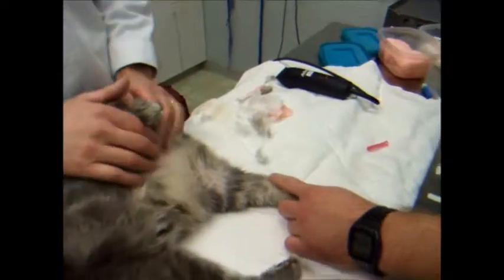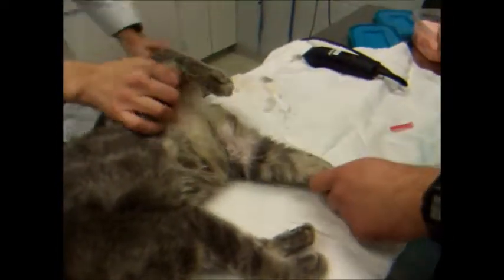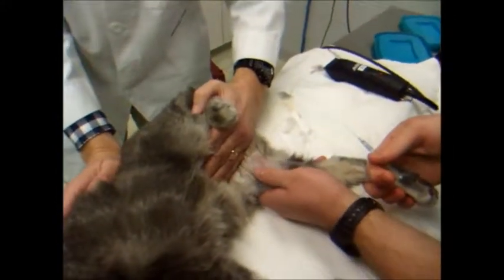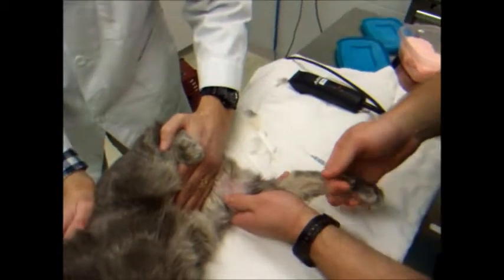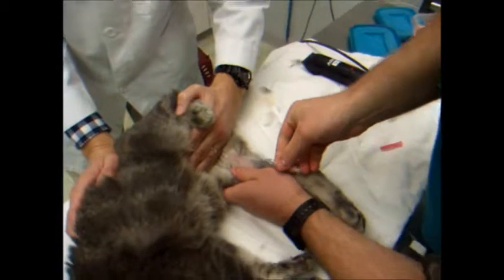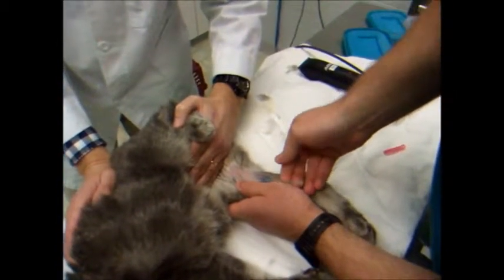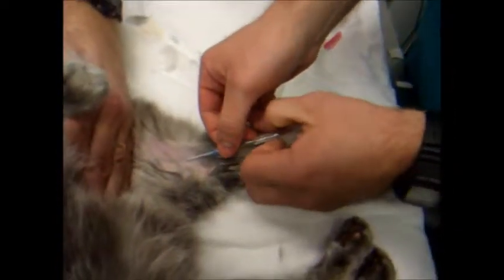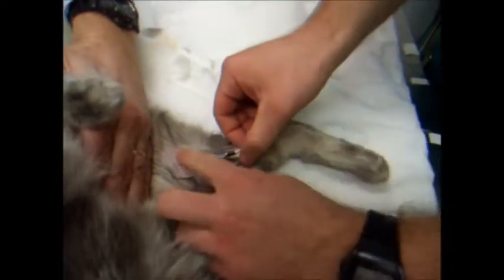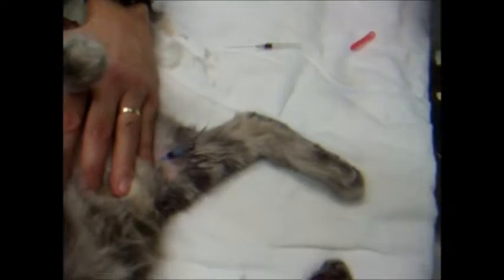Okay, 3rd scrub is done, so let's place the IV. Dr. Burke is going to kindly hold off the vein. I'm going to stabilize it with my thumb. We're going to use a 22 gauge. We're going to look for a flash of blood. Right there, and then we're going to advance the catheter. Alright, so we got a nice flow, which means it's in.